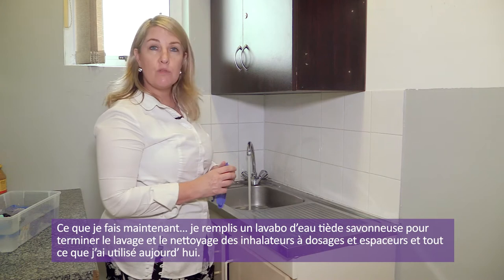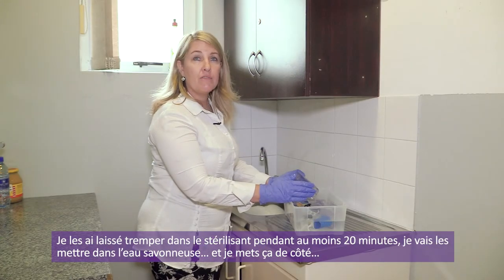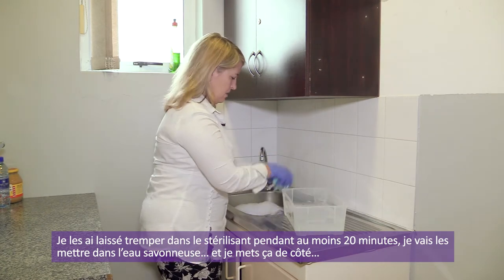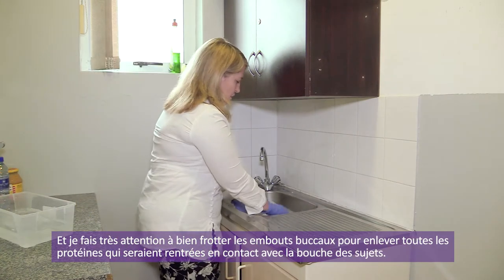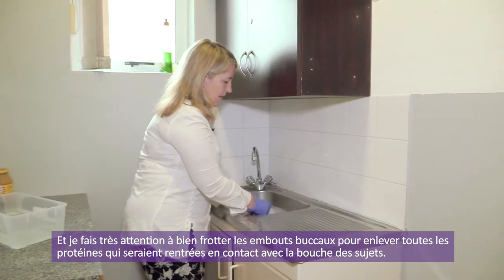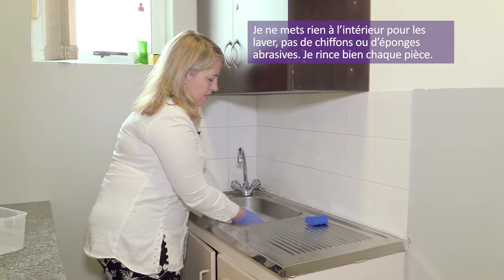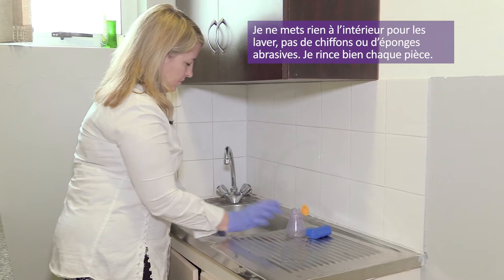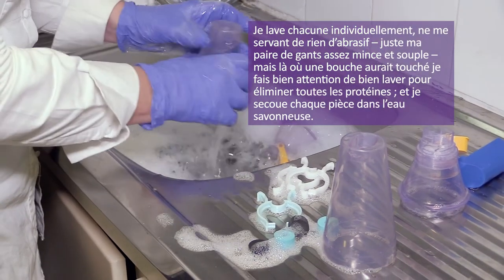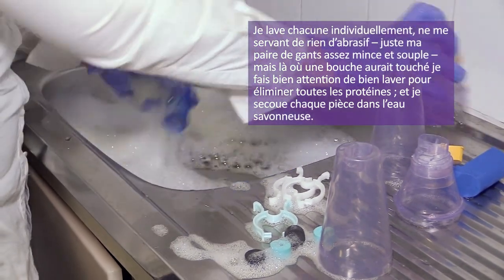I'm now running a basin of warm soapy water to finish washing and rinsing the equipment used today. Everything has been soaking in Milton for at least 20 minutes. I focus on rubbing the mouthpieces, taking all proteins off any part that was in contact with the patient's mouth. I do not stick anything inside these, and I do not use any abrasive cloths or green sponges — just rinse everything off.